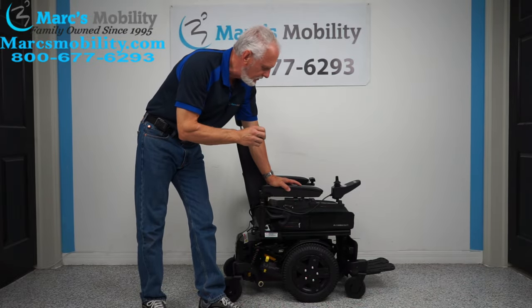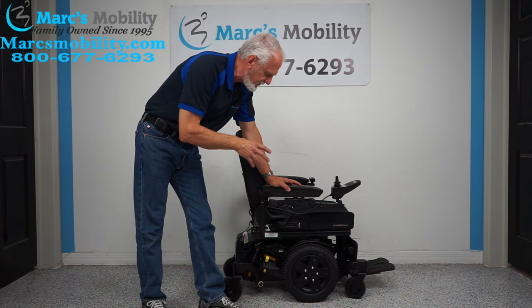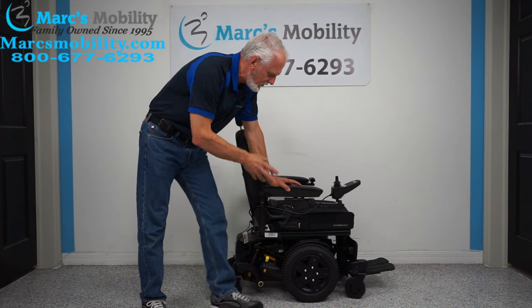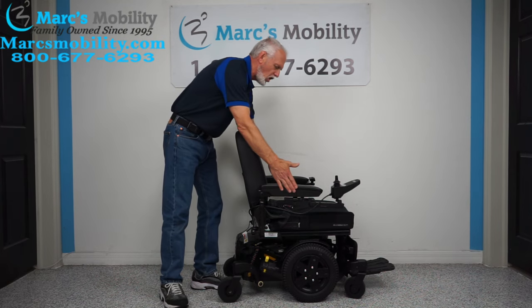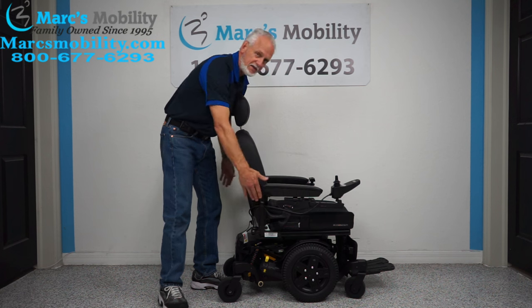Hi, we have here folks a Quantum Stretto power chair. This is the Stretto. Now this chair here, I'm going to tell you ahead of time, it's going to be sold with this seat on here. So even though the base right here from wheel to wheel is 22 inches, but from arm to arm is 25 inches. So your seat is wider than your base.